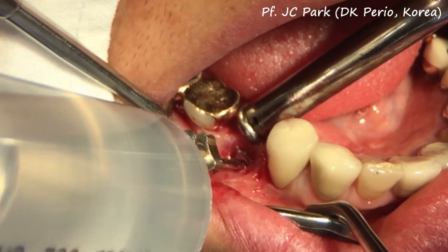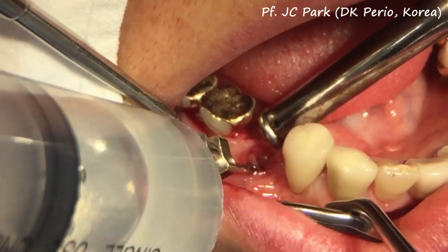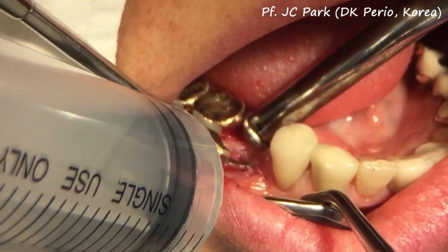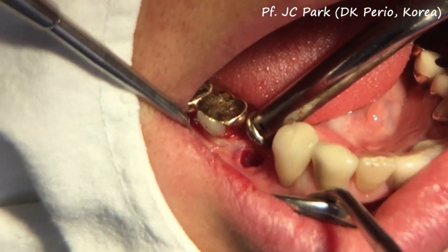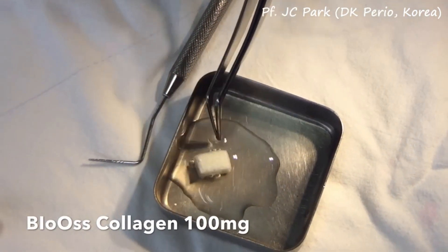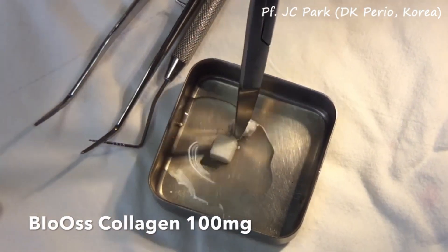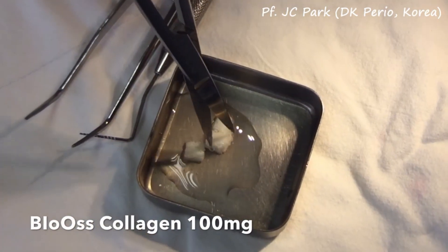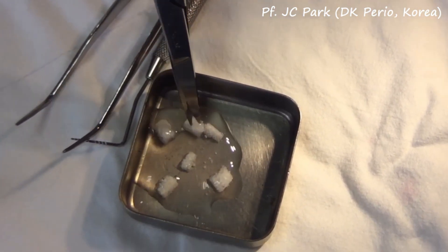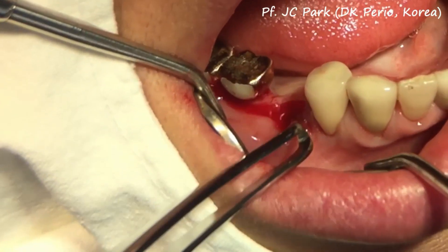The saline irrigation was repeated a few times to completely remove the debris from the explantation socket. The xenogenic bone graft mixed with 10% collagen was hydrated first and then trimmed into pieces with surgical scissors. The trimmed bone grafts are carefully introduced into the expanded socket.